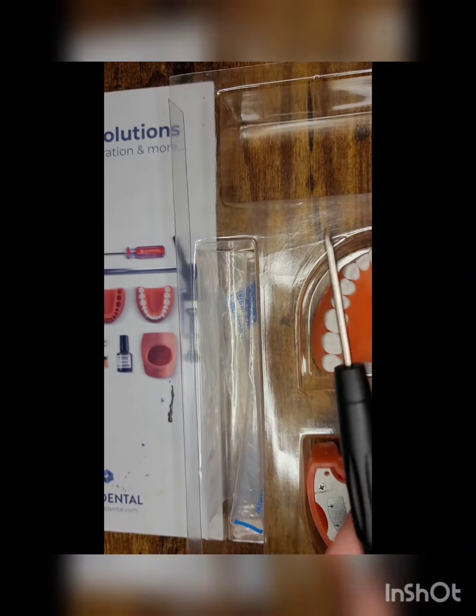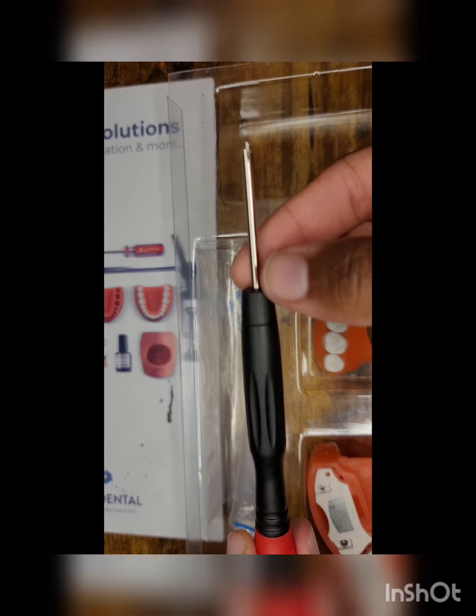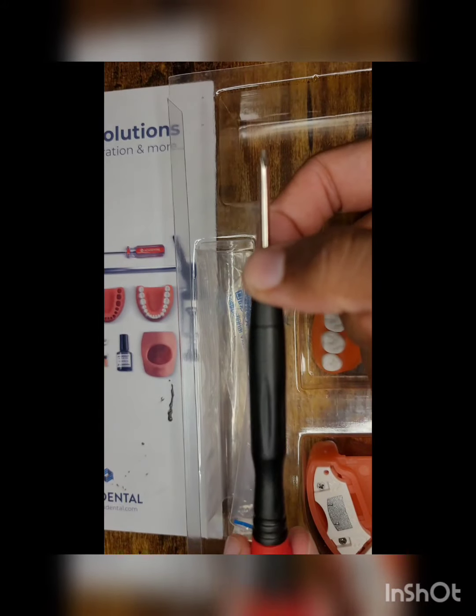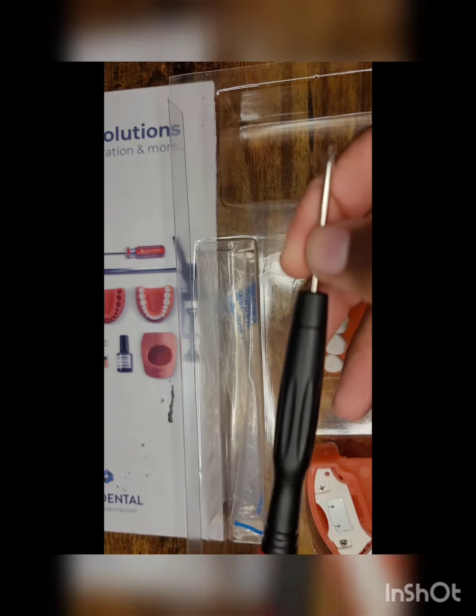Of course, it does come with your standard Accadental screwdriver. The tip of the screwdriver is magnetic — the one in my box was a bit weaker, so maybe it's just a defect. But this does work for all Accadental modules.